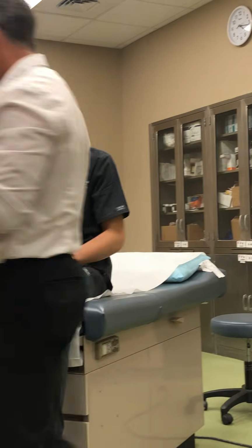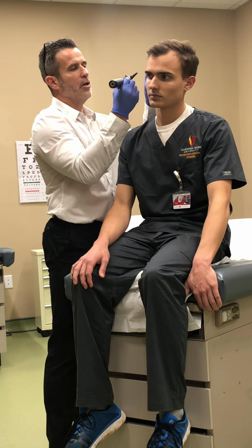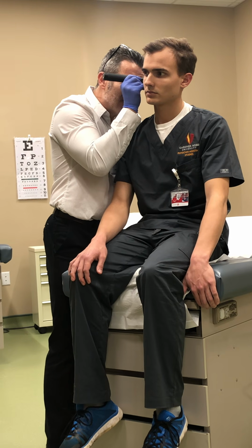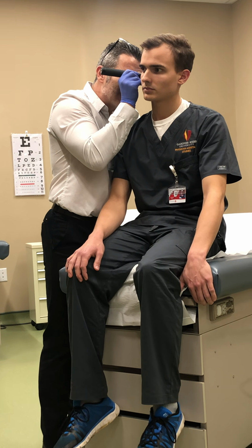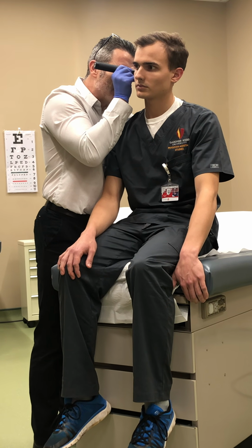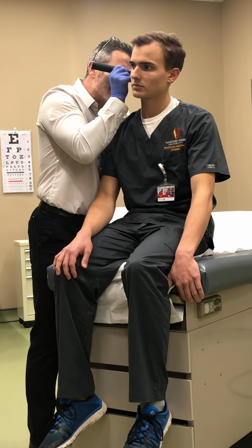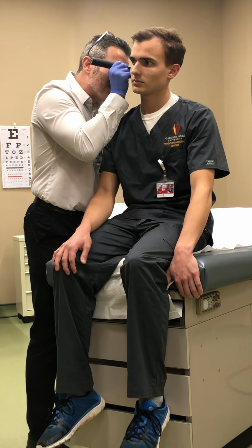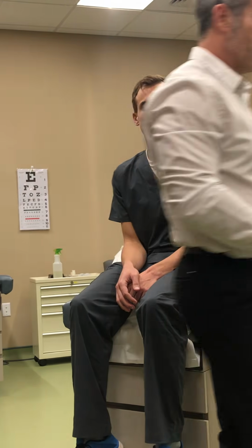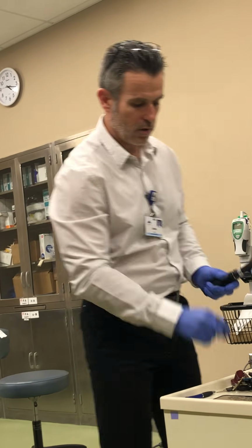When you go to the other side, what you have to do is here again, keeping the hand up, so if he jerks, up, out, and then here again, turning. Still has a great eardrum, clear, transparent. Kind of looking around, you can see everything, and I was noticing the ear canal as I went in, okay? Make sure you don't go too deep. You don't have to be very, very much in when you put the otoscope in if you know what you're doing, okay?